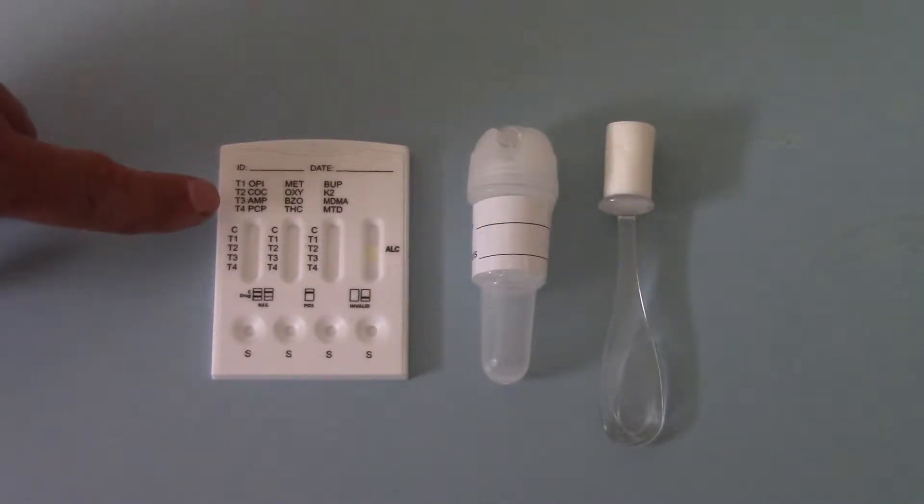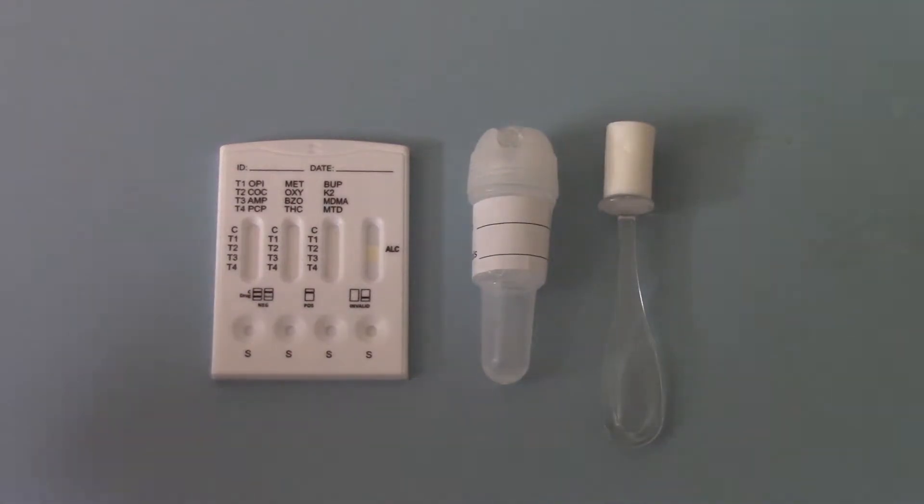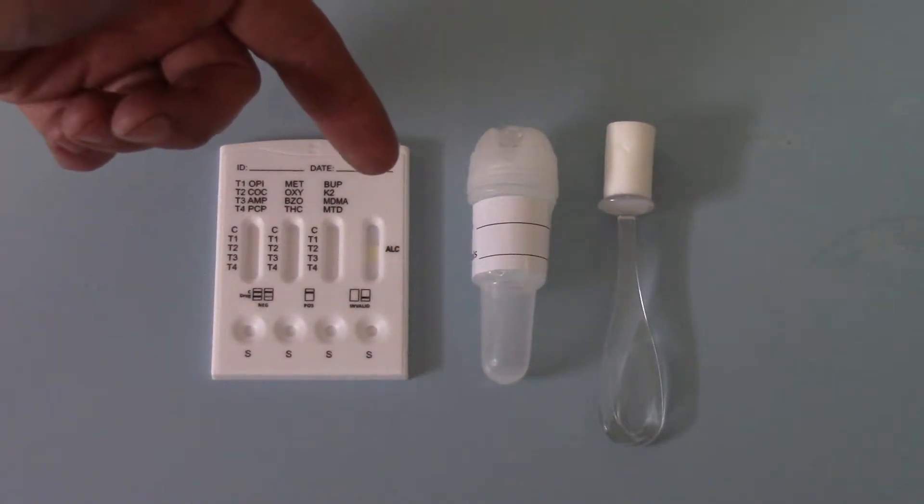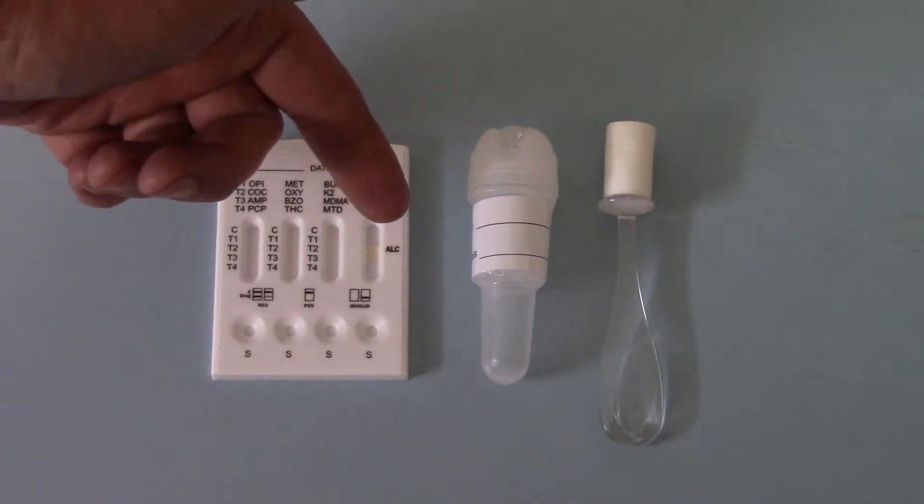So in this column here on the left hand side, T1 is an opiate screen, T2 is the cocaine screen, T3 amphetamine, T4 PCP, and that goes across all three windows. And then on the very right hand results window you have a single alcohol test screen panel pad.